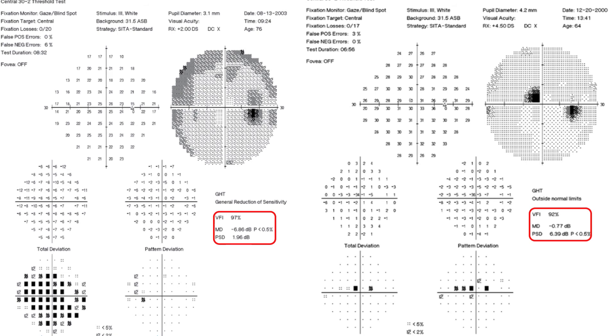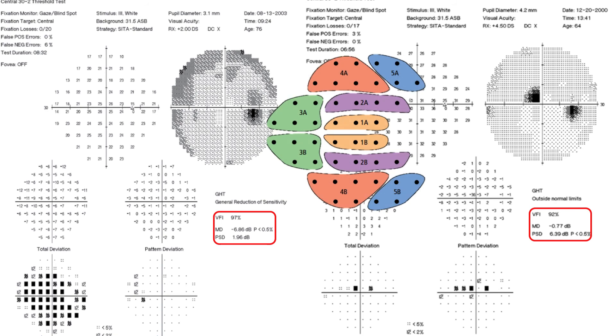On the right side, we have only a few depressed central points with a mean deviation of minus 0.7 and VFI of 92%. The GHT on the right side is reported as outside normal limit because the points in zone 1A threshold value have been lower than the threshold value in zone 1B.